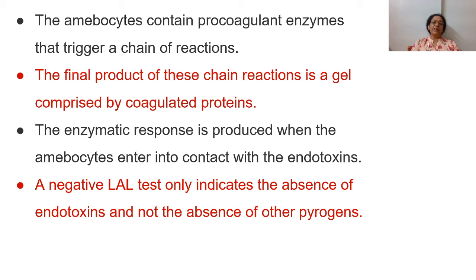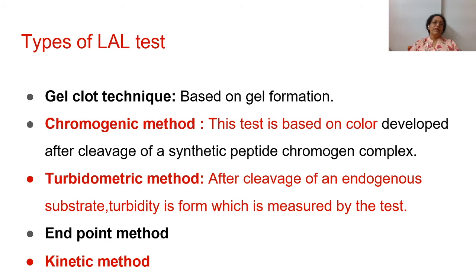A negative LAL test only indicates the absence of endotoxins and not the absence of other pyrogens. So this is a limitation of the LAL test. That is, only lipopolysaccharides from gram-negative organisms are detected by the LAL test, but not other pyrogenic substances which are of some other origin.